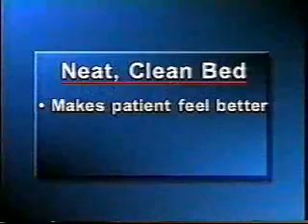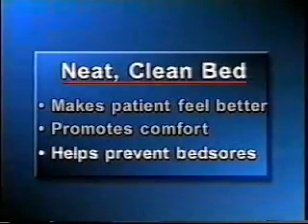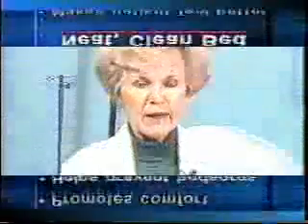A properly maintained bed makes patients feel better. It also promotes comfort and helps prevent decubitus ulcers, also known as bed sores. If a person can get out of bed, it's much easier and better if that happens, and the bed can be made at that time. This is called making an unoccupied bed.